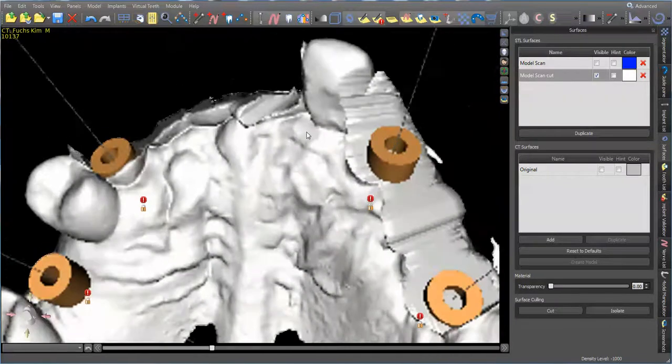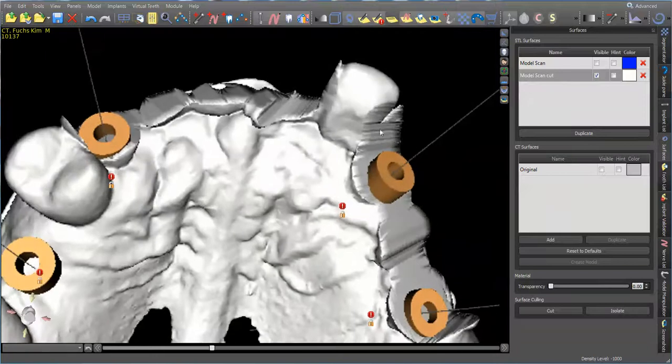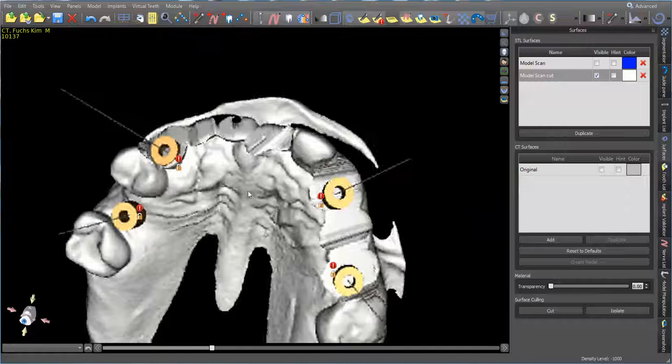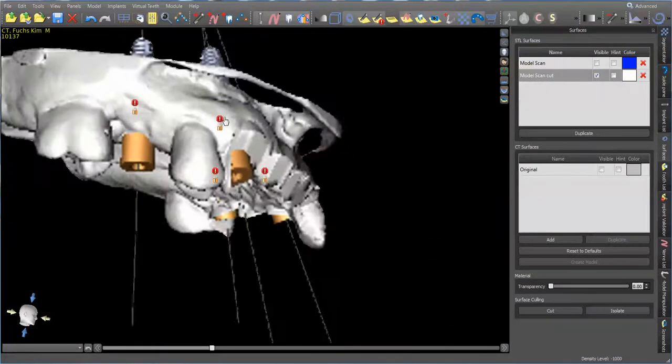You can see I did trim a little bit of this lateral off, which is going to be an issue. So I can either go back and remesh this or add this back, or just once I 3D print my little guide, I can just trim this out knowing that it's not going to seat fully. You can actually also 3D print this if you wanted to double check it before the patient's scheduled. So I just kind of have a rough cut of what I'm going to be doing.